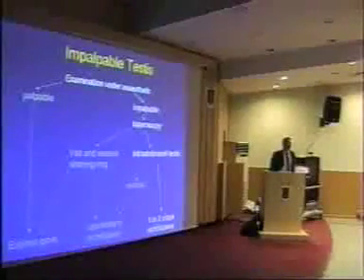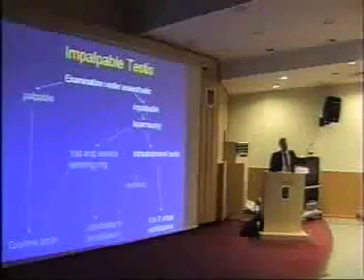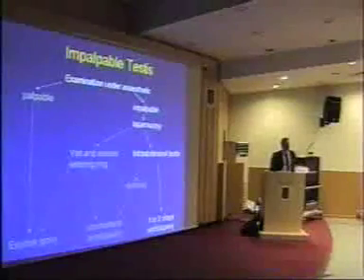If you're doing simple nephrectomies in an adult population, and you're also going to be doing radical nephrectomies by the transperitoneal route that you saw earlier on, I think it's perfectly fair that you should do all your nephrectomies that way. I don't have a problem with that.